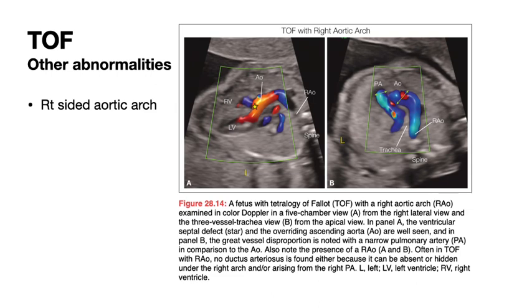So even though you start scanning and you have this suspicion there's an overriding aortic arch, you have a hard time finding the pulmonary artery flow, and you're thinking tetralogy, again, it all gets back to the same thing, which is, okay, well, you can be suspicious of that, but you still then have to do a very systematic analysis of everything, in which case you'll be finding the tracheal position in relationship to the aorta.